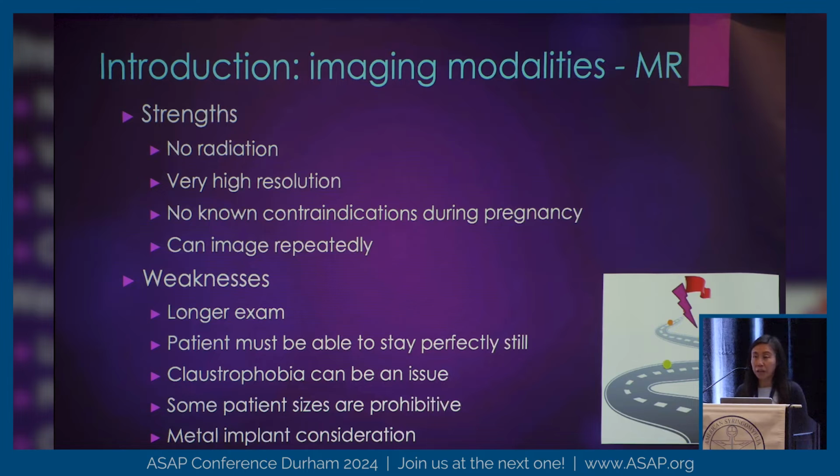It's no radiation. It's just a big magnet that you're sitting in or laying in, and it's spinning protons, precessing protons, we call it. And the different ways that the protons spin is how we get our imaging to have many shades of gray. It has very high spatial resolution, so I can see all sorts of tissues very, very easily to differentiate the different types of tissues.